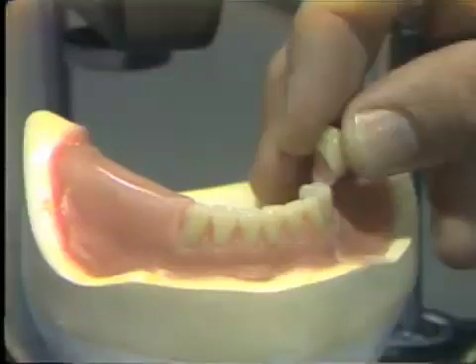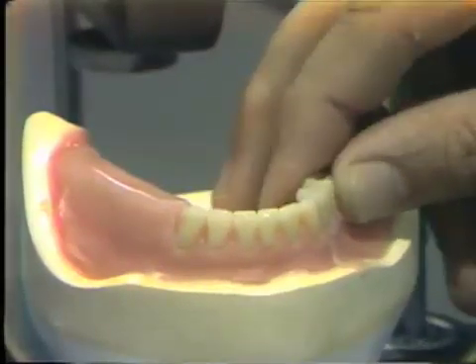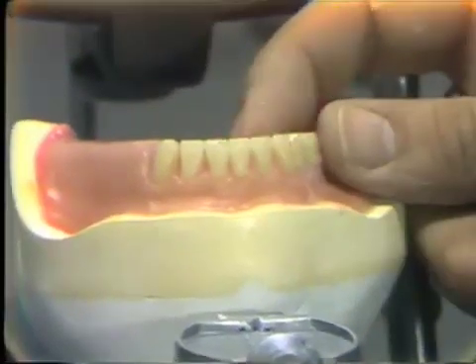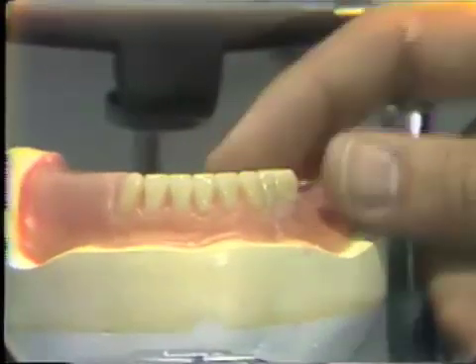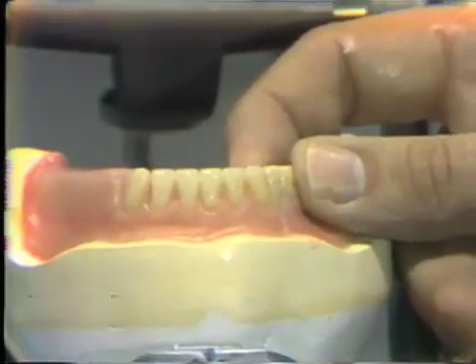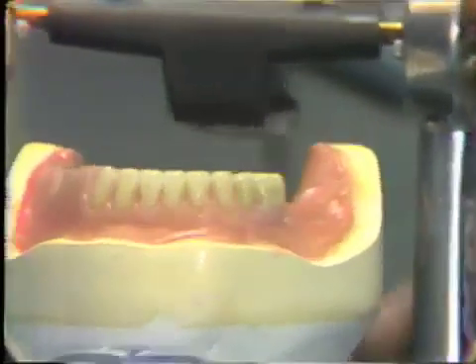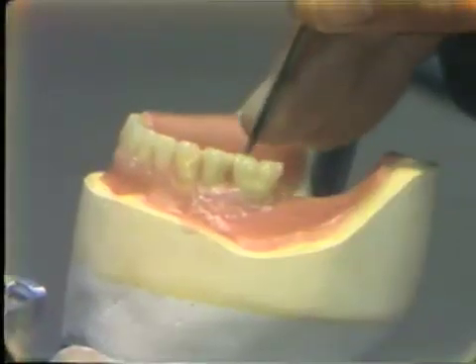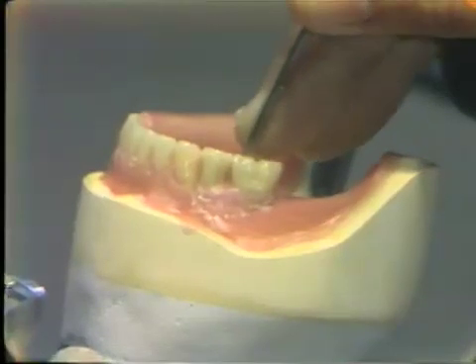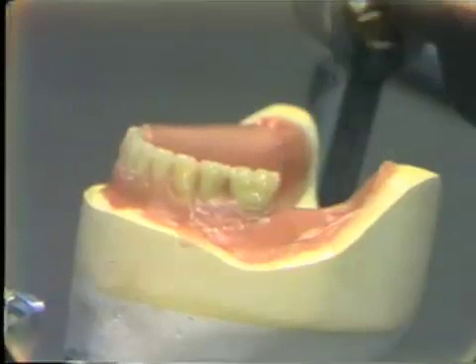Again we'll examine the molar in relationship to the bicuspid. Looking at it in this direction, you will see that we are fairly well lined up with the bicuspid. It appears as though the compensating curve medial-laterally can be accentuated a little bit by making the buccal cusp slightly more prominent. Now looking from the buccal view you will see that the mesial of the tooth is a little bit too high. I'm going to recess that slightly. Now the distal begins to incline towards the posterior part of the mouth.